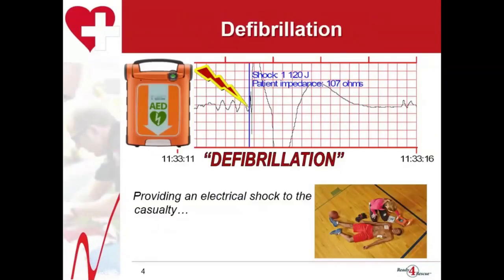This is where the AED comes into play. Defibrillation is required to reset the electrical activity of the heart. The AED is used to reset this activity.